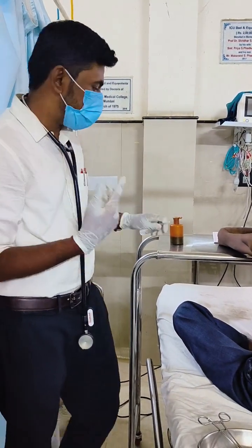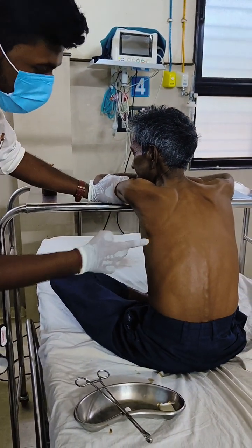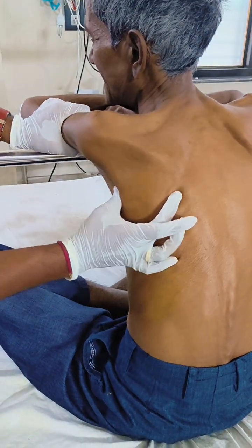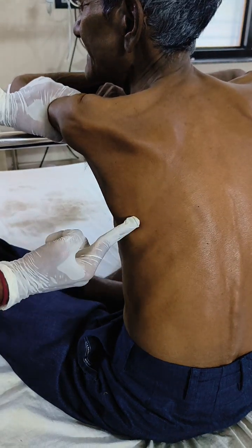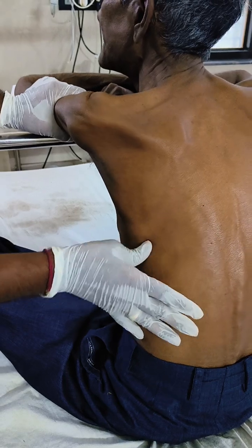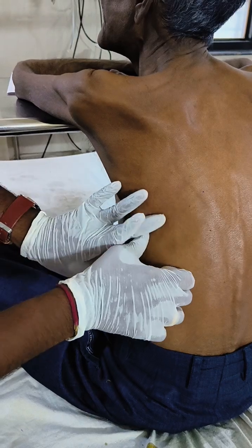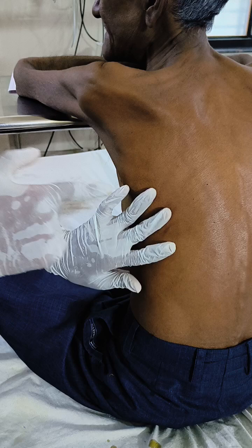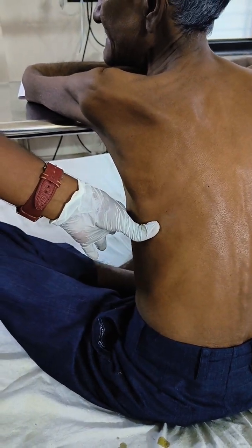So we will have tap now. We have to identify the space. You can see this clearly, the scapular bone is there. You can feel this scapula. Anatomically, the end of the scapula will be at the 6th to 7th intercostal space. So just below this, the 8th intercostal space, we can tap. Just before pricking we will percuss. Yes, there is a stony dullness note here.